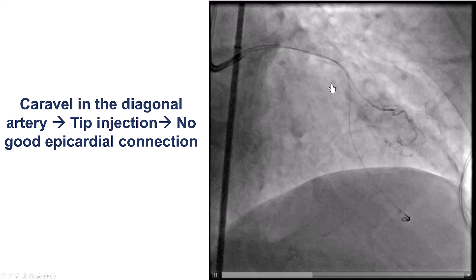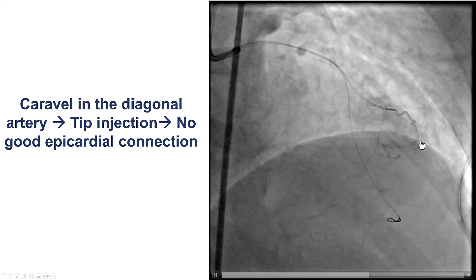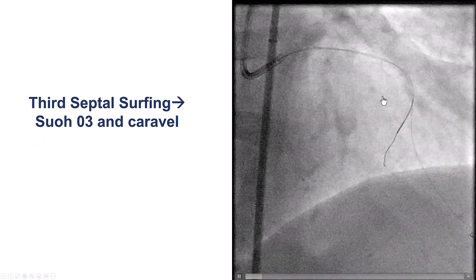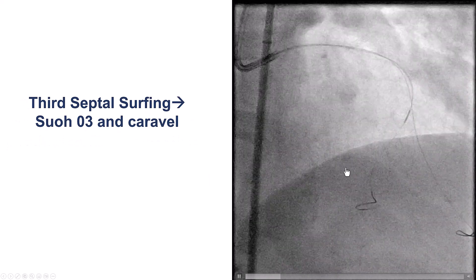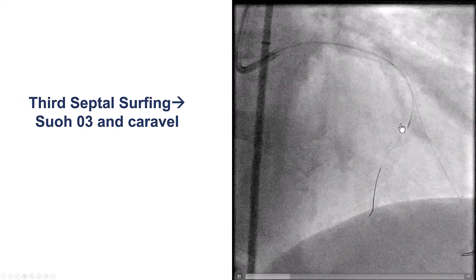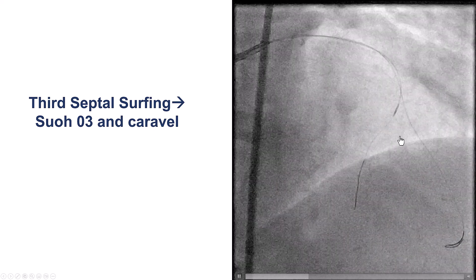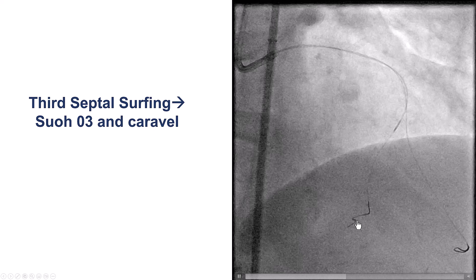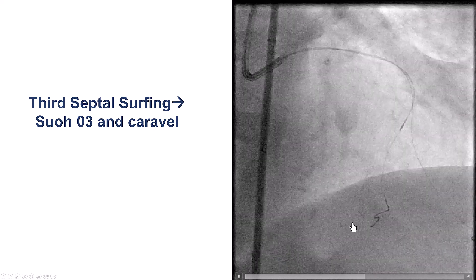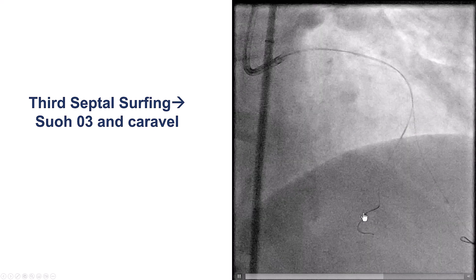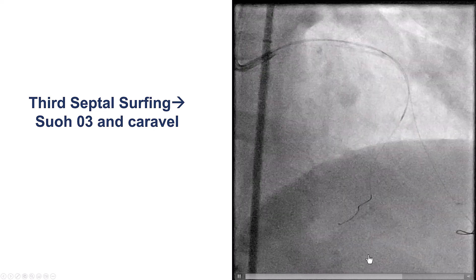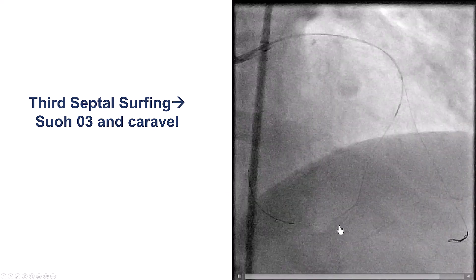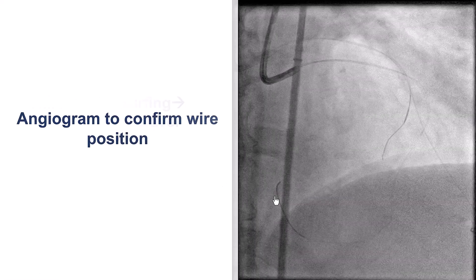We advanced the Caravel microcatheter and tried to understand the connections. The epicardial connections were not very good, so we did surfing of the third septal using a Caravel microcatheter and a Suoh 03 guide wire. Those septals were fairly tortuous, so we were moving back and forth, withdrawing the guide wire and advancing with constant rotation. Eventually there was some release, and the wire seemed to be going in the right direction.